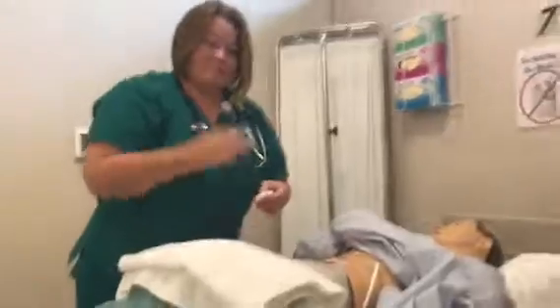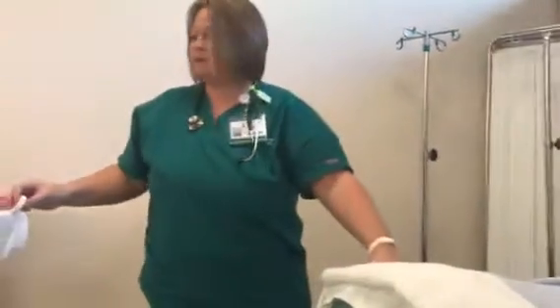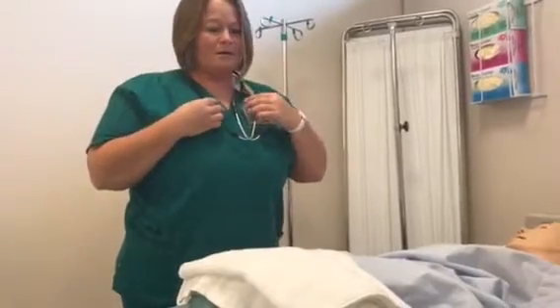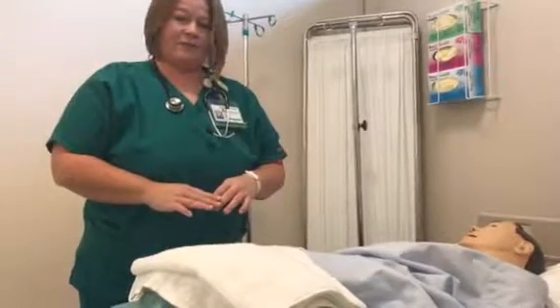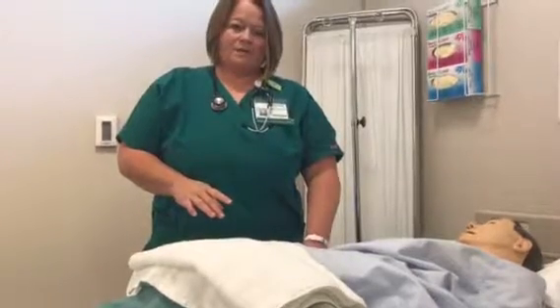I need to look at some lab values, assessing my patient for any fluid excess or deficit. I'm looking for any electrolyte abnormalities or metabolic abnormalities such as hyperglycemia. Then I'm going to check my physician's orders, and I'm looking for the formula, the rate, the route, the frequency, and I'm also going to be looking at the flush amount and frequency as well.